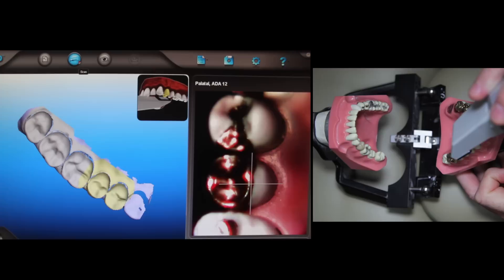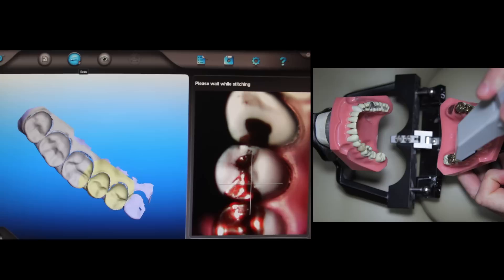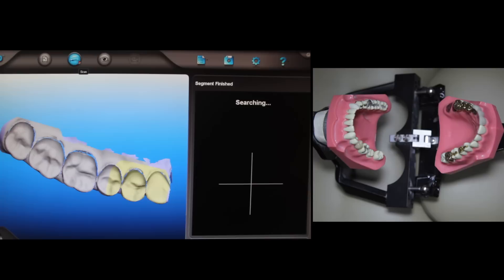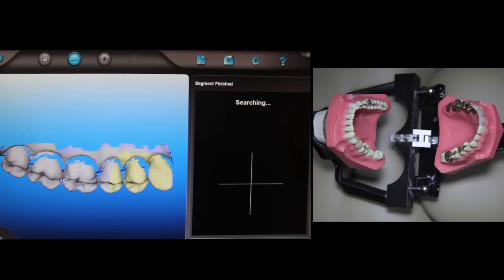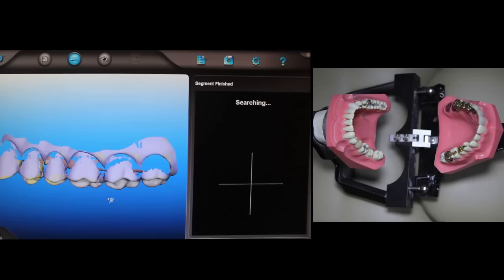So we start with the opposite side from where we're actually doing the crown. So that whole upper is done. And if I have any doubts about that, I can grab it and spin it around, look at it and make sure all the information is there that's needed. Any of the blue places are places where there's information missing, but it isn't critical to the success of the case in this particular instance.